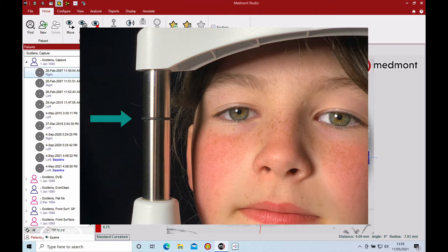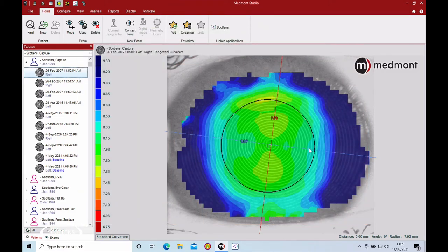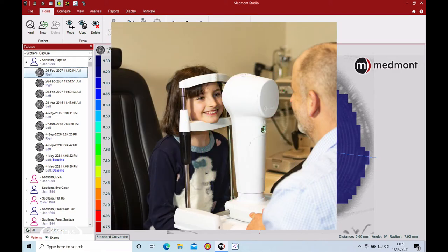Particularly with kids, sometimes you want to get them to stand at the topographer in the chin rest rather than sitting down on a booster seat, where they tend to be a little bit too short all the time.